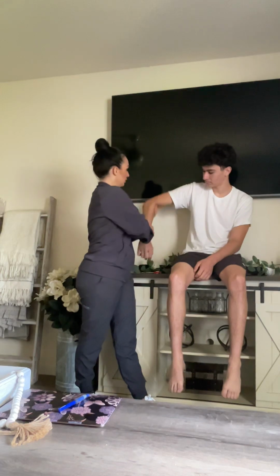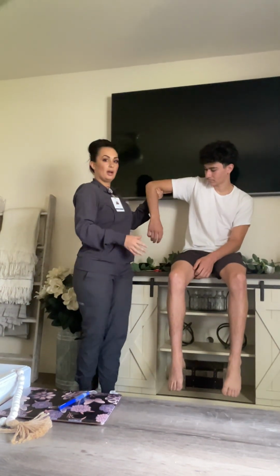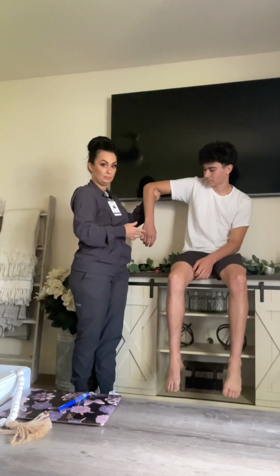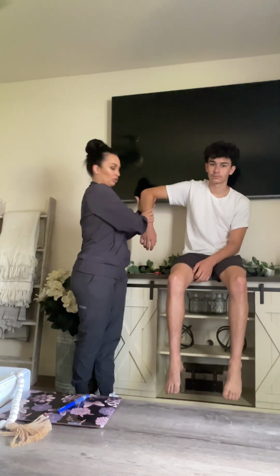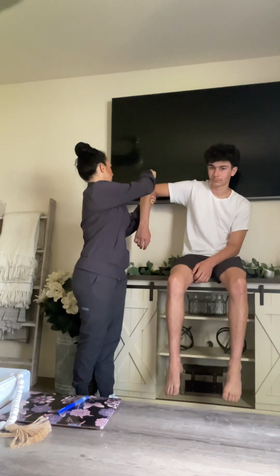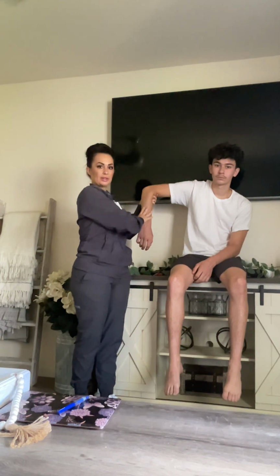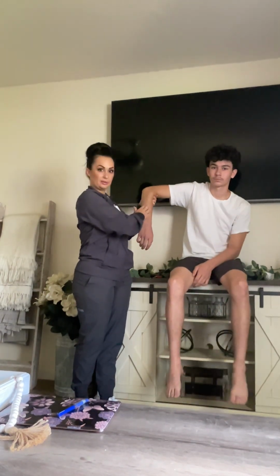Next, we're going to do the triceps. So we're going to make sure the arm is up, relaxed, and in an L shape. The arm should also be relaxed, so go ahead and just fully relax, and I will support the arm. I'm going to find the tendon above the elbow and tap it with the pointed end of the hammer. All right, perfect. So the forearm did show normal responses there.